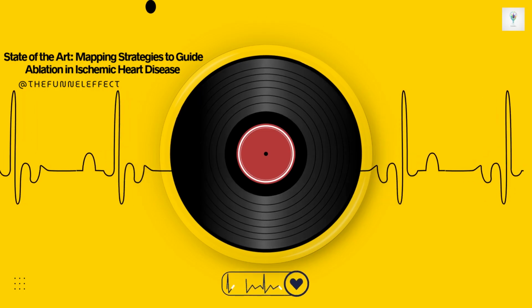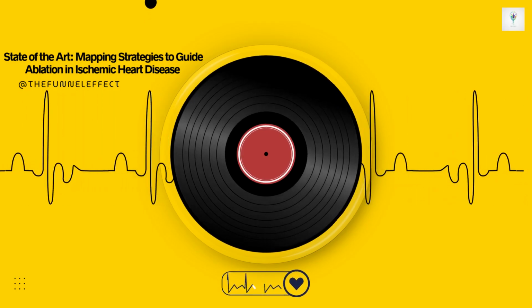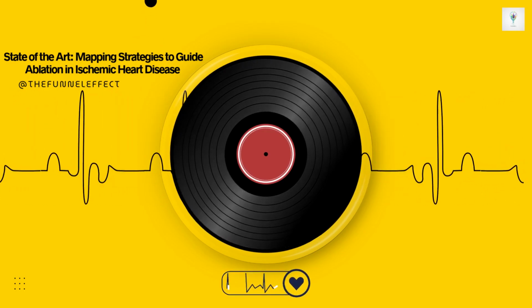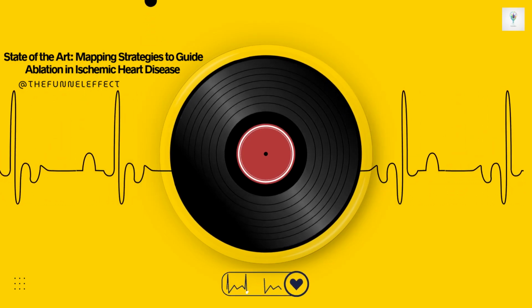A sort of scorched earth policy for the scar zone? How well does that work? The results can be pretty impressive, actually. Studies have shown good outcomes, with some reporting up to, say, 81% of patients being VT-free after this kind of extensive endocardial homogenization. What's really important, though, is the willingness to go epicardial, map and ablate on the outside of the heart if needed.